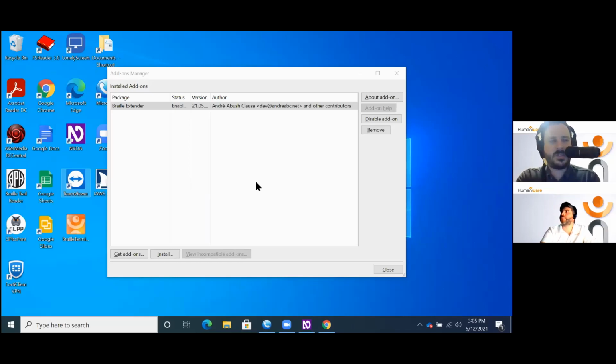I'm going to stop my screen share here. Alt plus S, left control. Oh, it would help if I turned off keyboard help. So I'm going to press Command keys 1, 2, 5. C1 plus C2 plus C5. Input help off. Now I have my input help off, and I'm going to actually stop my screen share.